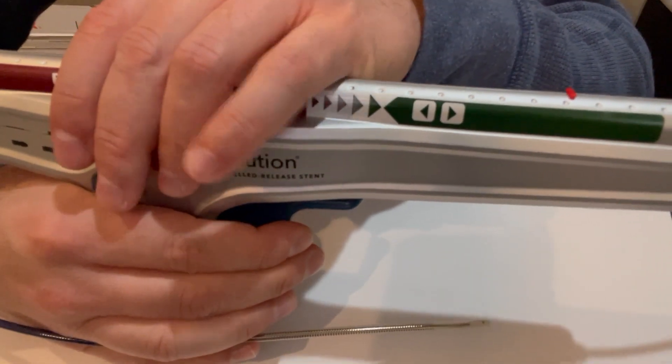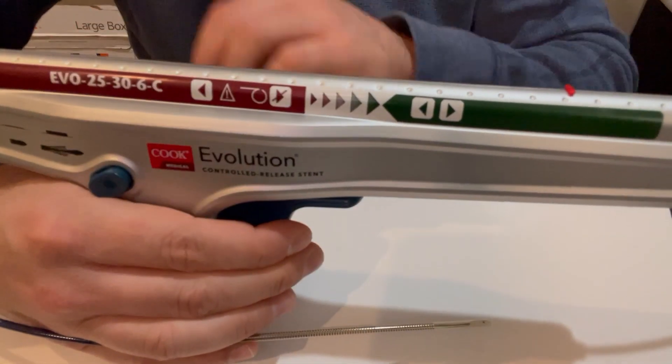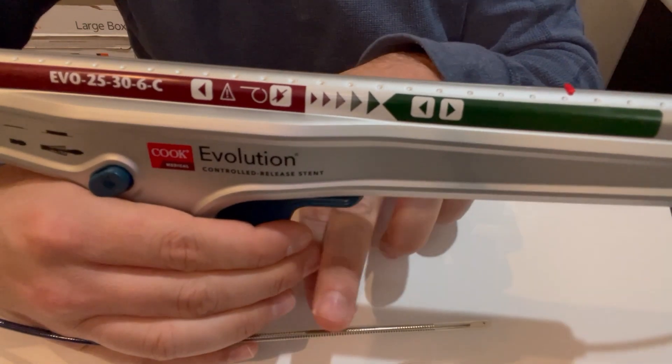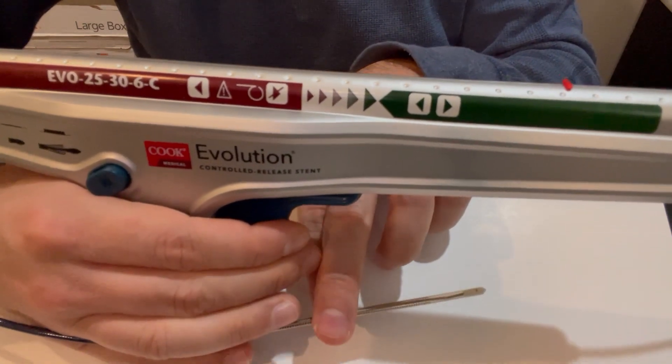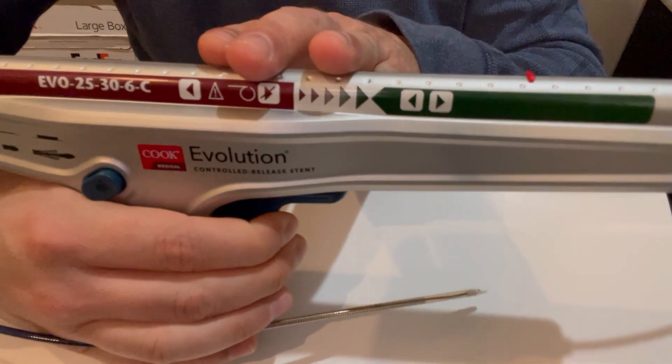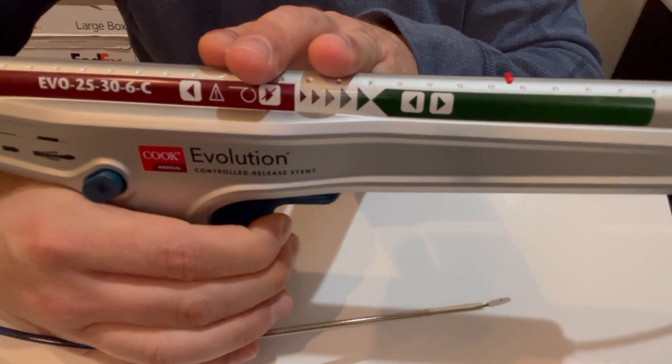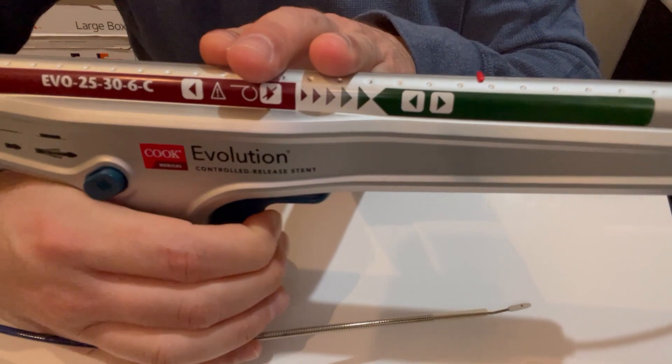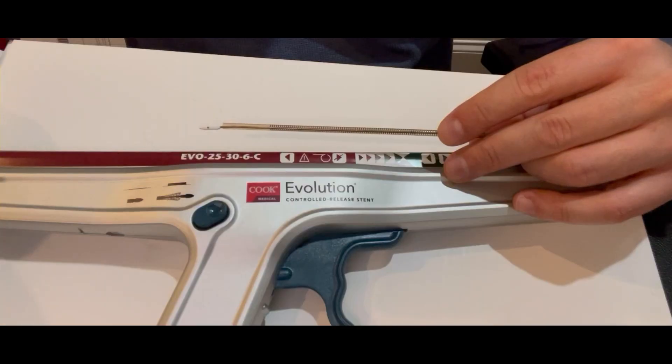Now you want to deploy it again. You can pull the trigger the same way and the stent will deploy.